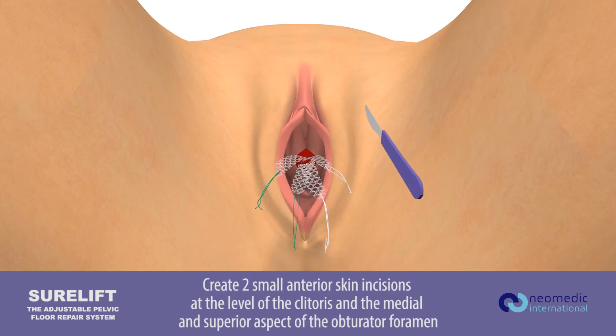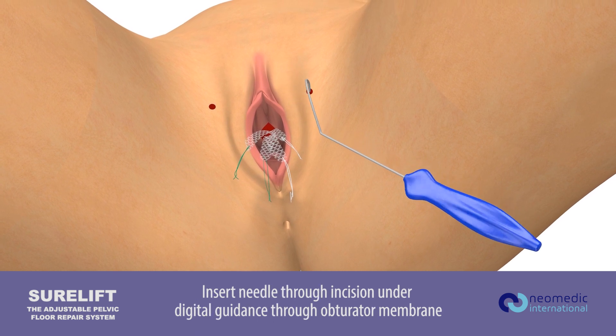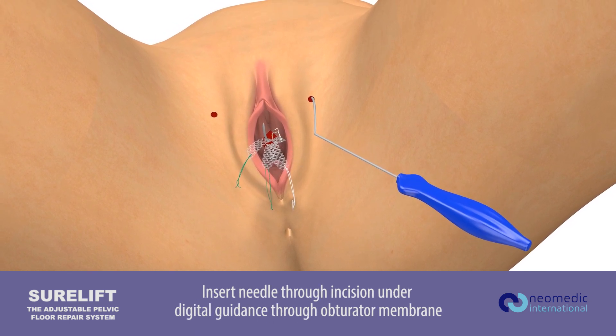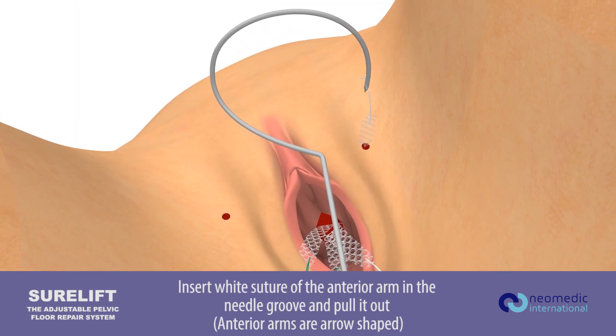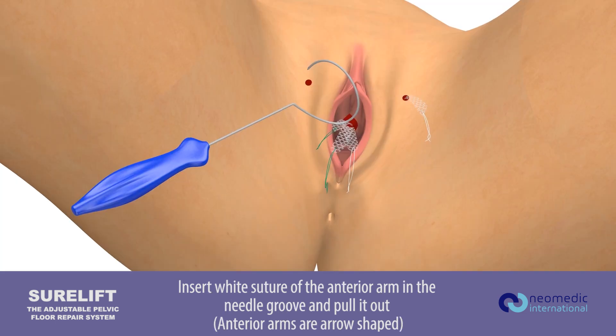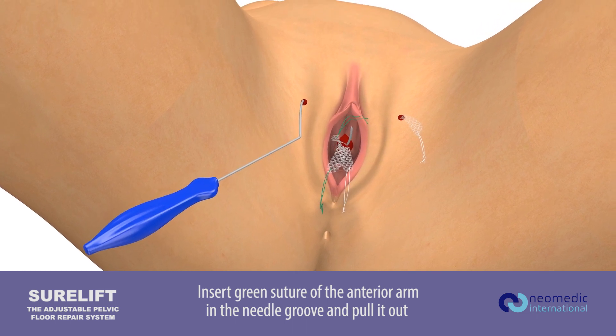Create two small anterior skin incisions at the level of the clitoris and the medial and superior aspect of the obturator foramen. Insert needle through incision under digital guidance through the obturator membrane. Insert the white suture of the anterior arm in the needle groove and pull it out. Insert the green suture of the anterior arm in the needle groove and pull it out.